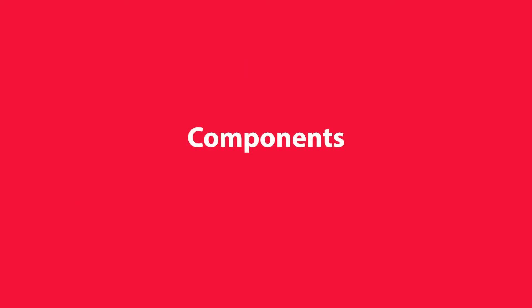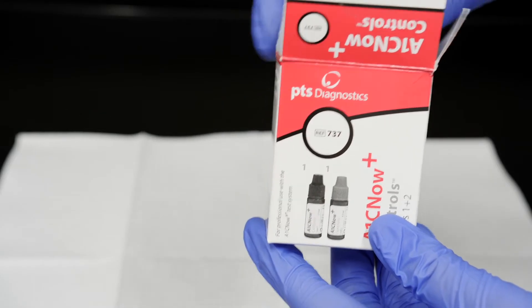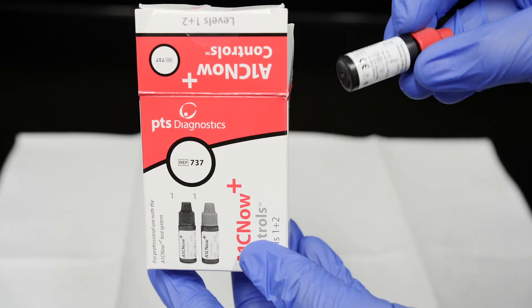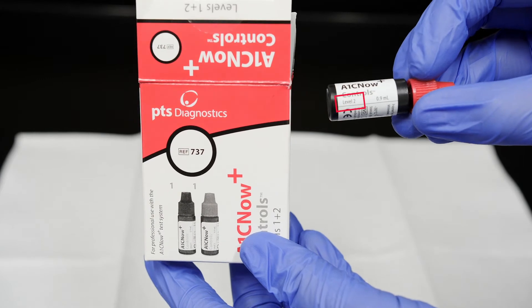Components. A1C Now Plus controls contain ready-to-use blood-based Level 1 and Level 2 controls in 0.9-milliliter dropper-style vials and instructions for use.